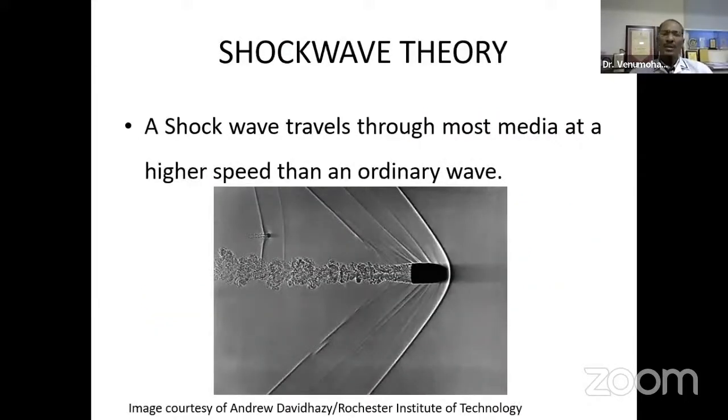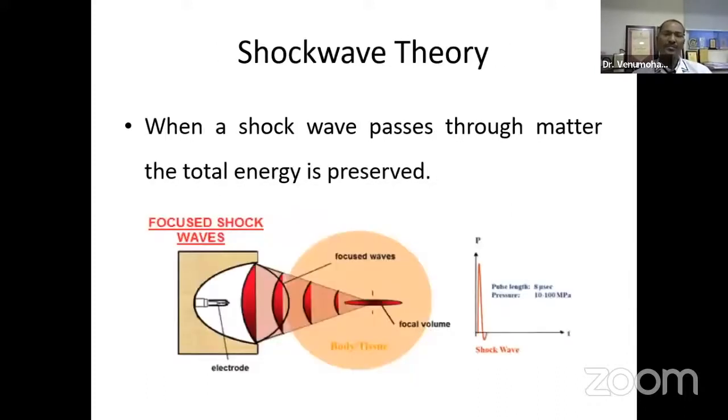Now, first thing is we should understand what this shockwave therapy is. It is the sound wave which travels through most media with a higher speed than any other ordinary wave. So this image is a great image which shows you how a shock wave travels through the media and produces the acoustic waves or the shock waves.